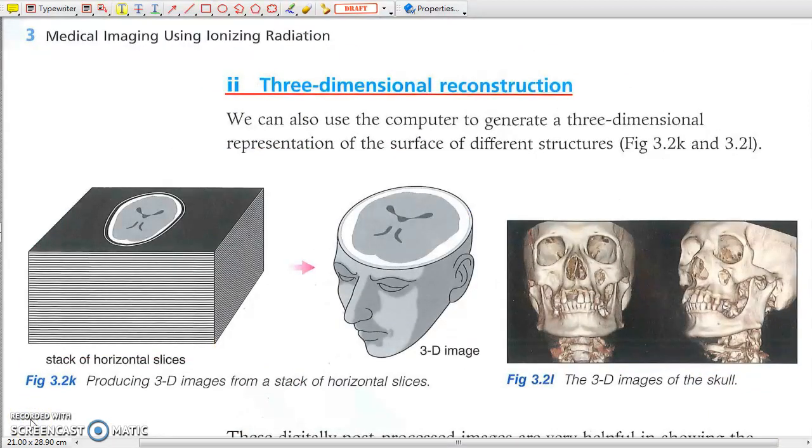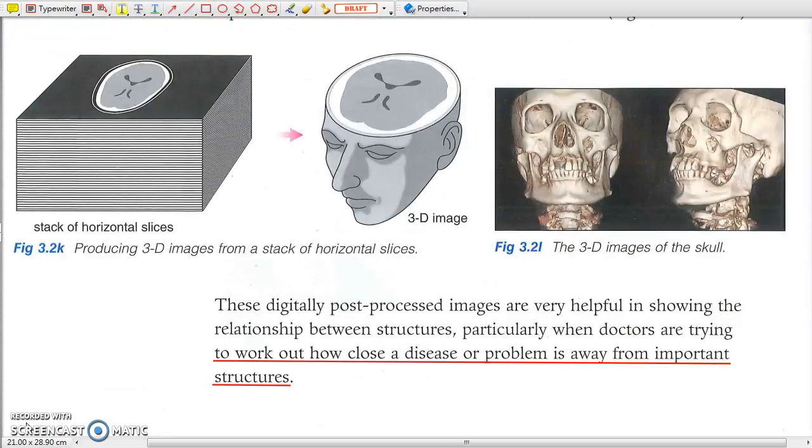2. Three-dimensional reconstruction. All the tomographs generated may also create a simplified 3D model with selected tissues or organs only, to allow the doctors to examine any fine details of the corresponding body tissues.